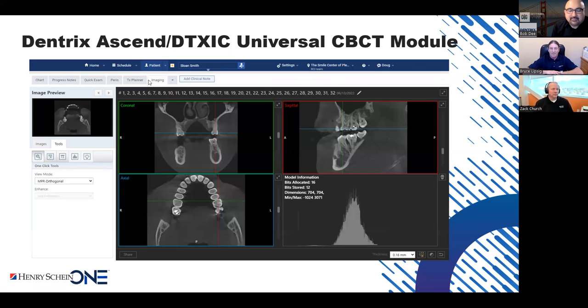If you click, I mean, this is a slide, you can't click on it, but if you would click on a chart, you go to the patient's chart. You have treatment planner. It doesn't show on this slide, but you can look at the ledger, imaging. All of those tabs are up there for you to customize and to look at. It's a very clean user interface, is what I like to call it.